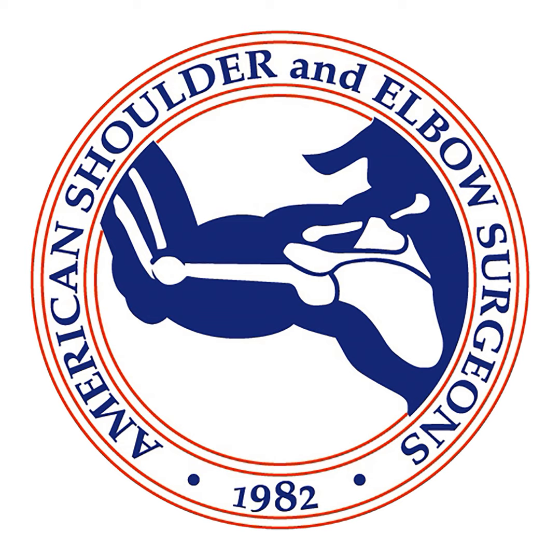If you look at the clinical outcomes, despite all the advantages that we've talked about, bone preservation and so on, at the end of the day, the clinical outcome is as good as stemmed implants. So it's not inferior, but it's not a superior implant in terms of range of motion and radiographic complications like loosening or subsidence and patient outcome measures. So there's nothing wrong with doing a stemmed implant if that's a surgeon's preference, in my opinion.